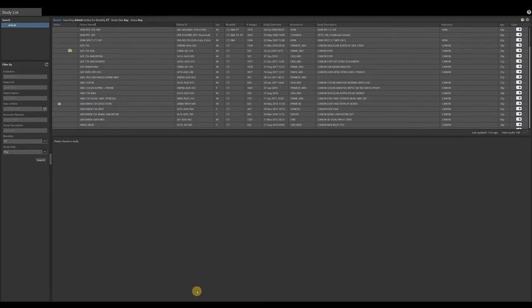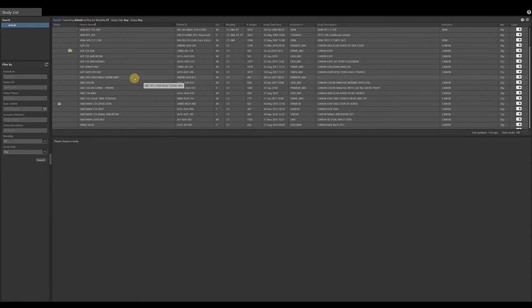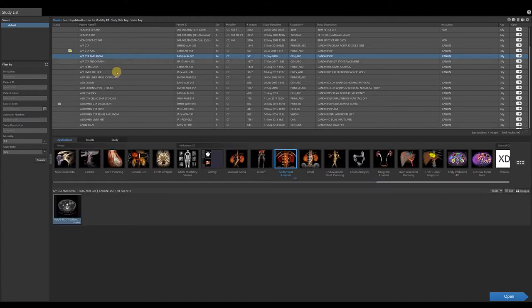This is a video demonstration of the endovascular stent planning application. With a single left click, select your patient exam record. On the applications bar, with a single left click, select endovascular stent planning.